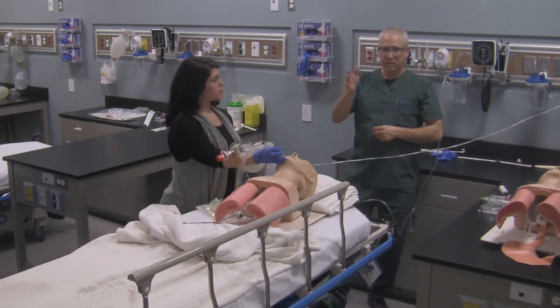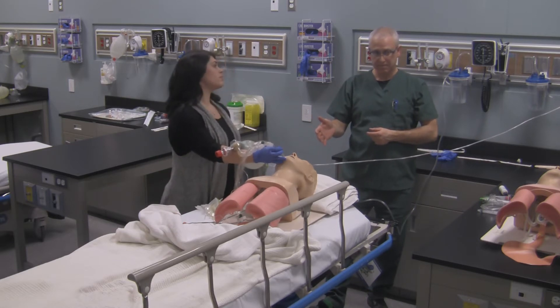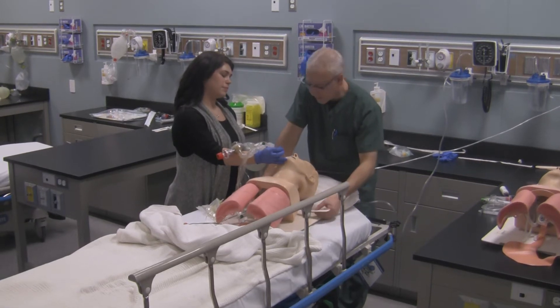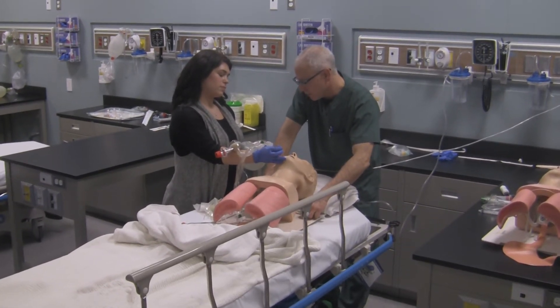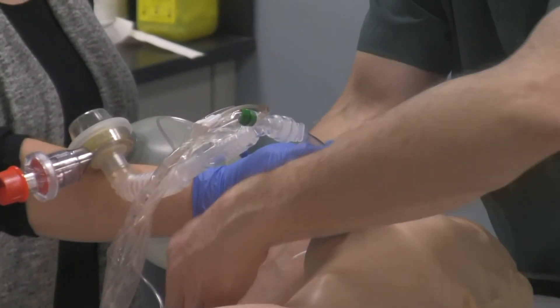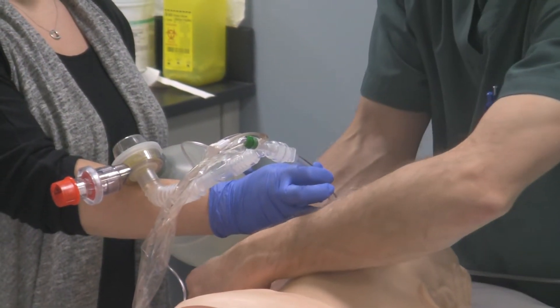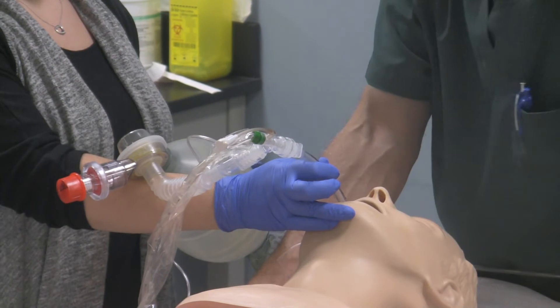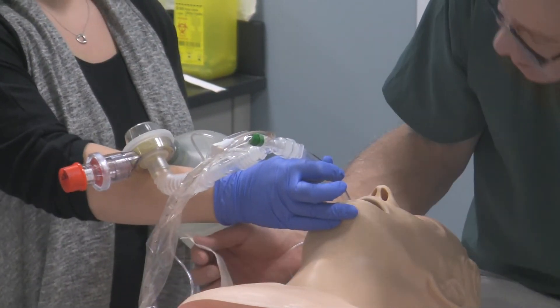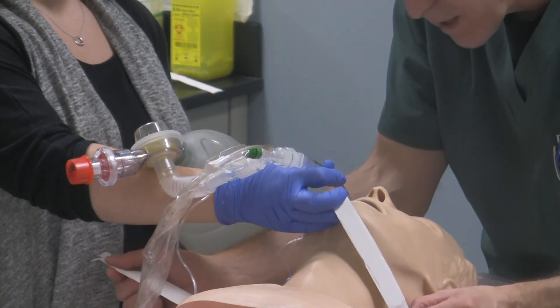So the sequence is: bottom, top, top, bottom, top, tube. This is where we find out if the tape set that you made is adequate. I'm going to get you to hold this side here, and you also need to center where the double-sided part is.